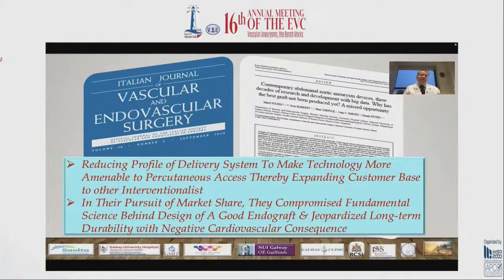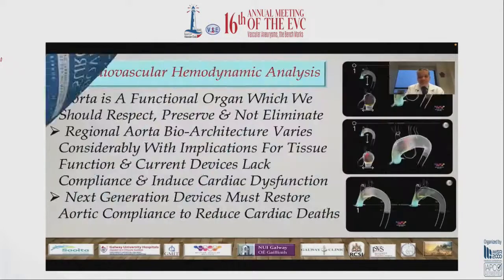So the multinationals are interested in selling to the cardiologists and the interventional radiologists, who cannot do a cut down. So they want to decrease the profile in order to sell more. In their pursuit of market share, they compromise the fundamental science behind the design of a good endograft and jeopardize long-term durability with negative cardiovascular consequences.